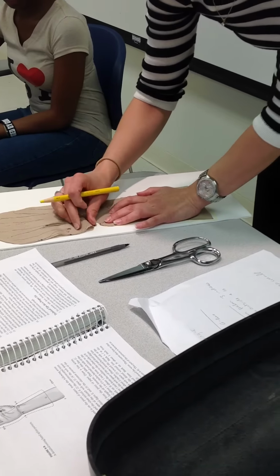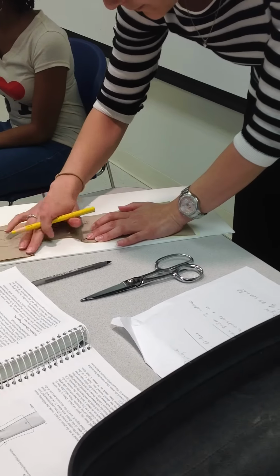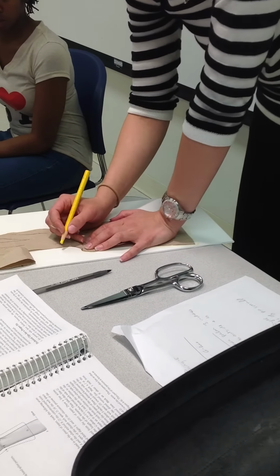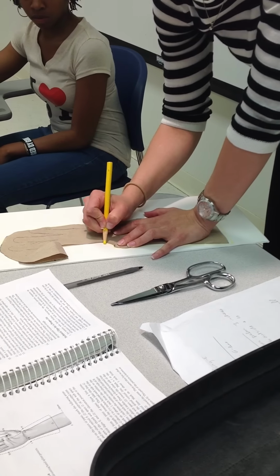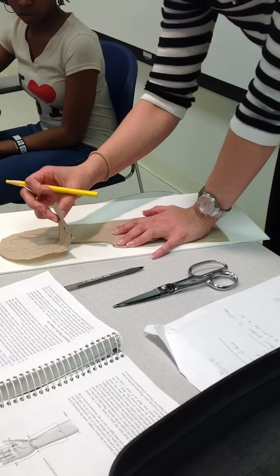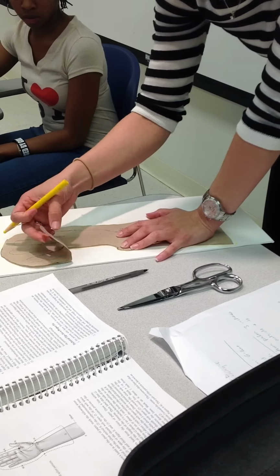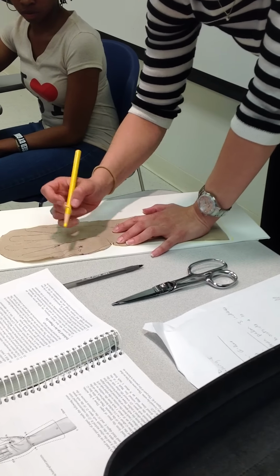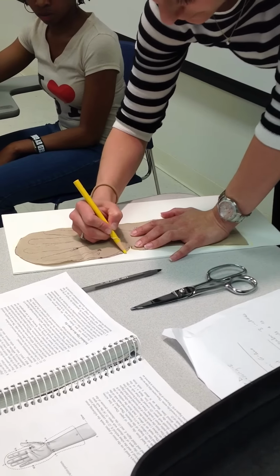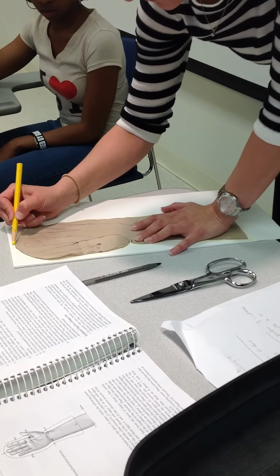Now this part's pretty much impossible not to have a yellow mark. So if this is the only place your yellow mark is, then we won't count off. Which part? The thumb part. Like this part right here that I'm cutting. Here's my flap, because you're only making one cut in there. Okay. So you're going to have yellow there.